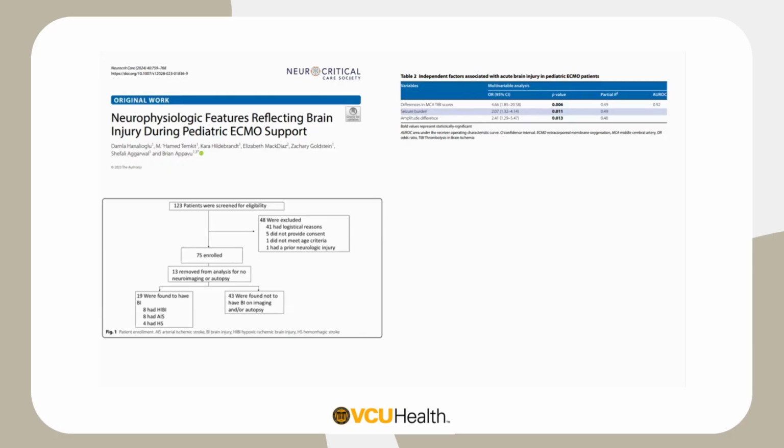Other studies to date have described a trend for velocities or pulsatility indices toward injury. We did not see statistical significance with any specific flow velocities or PIs. I think ECMO is extremely dynamic: changes in sweep, blood pressure, pulsatility. It changes all the time for these patients.